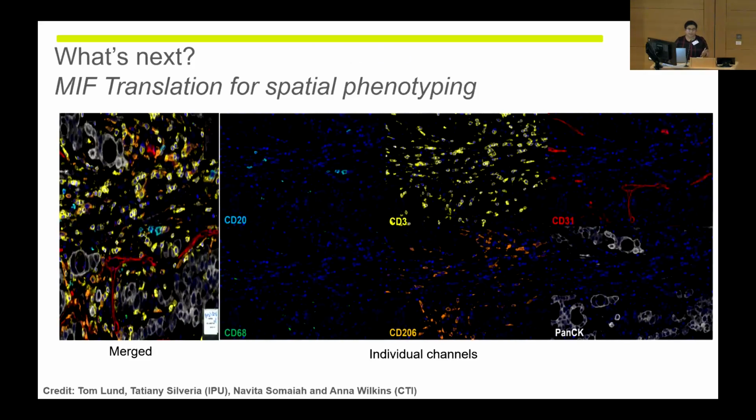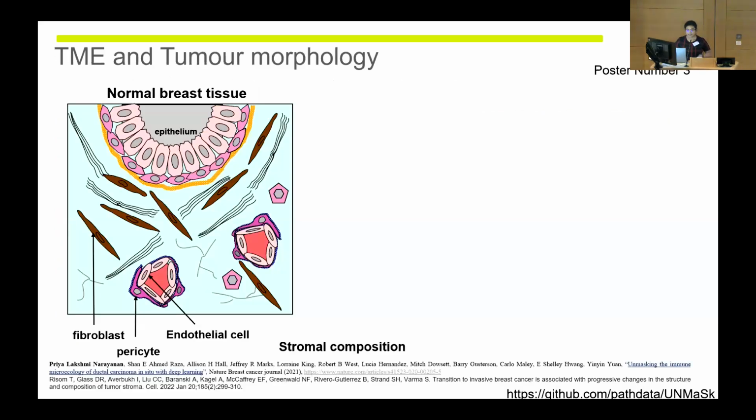And we also think that blood vessels don't exist alone in a tumor microenvironment. There are also other adaptive immune cells such as T cells and B cells existing in the environment. So we are looking at expanding the generalizability of the model, encapsulating the morphology but also the cell-level details that we can add when we have enough of the MIF images that we acquire as part of this trial, and other collaborations with the PhD students from the CTI lab in ICR.